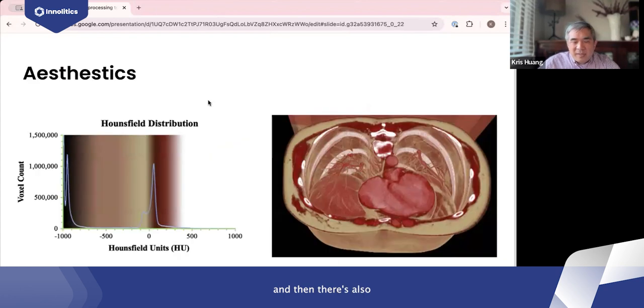And then there are also all sorts of color maps we can use just because they look cool. Particularly for 3D rendering, it's just a fun thing to do. It was kind of fortuitous that Matt had mentioned dealing with TeraRecon a little bit earlier in one of the other channels. I think they had their claim to fame starting with 3D renderings of things.